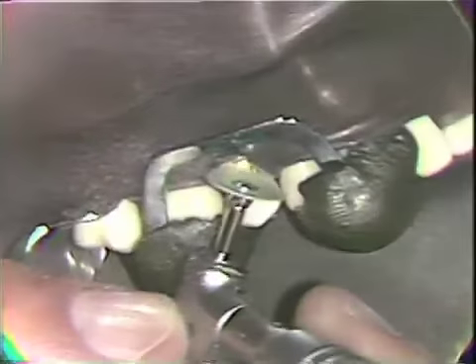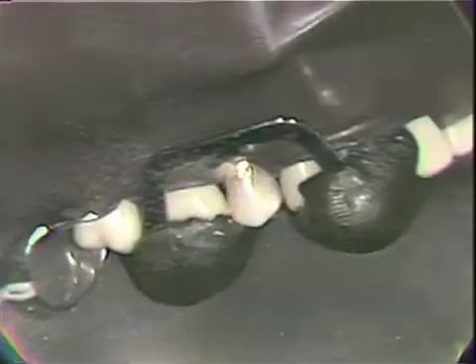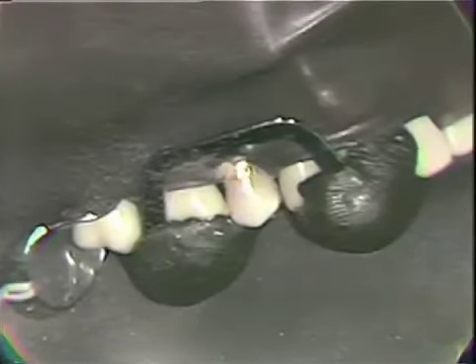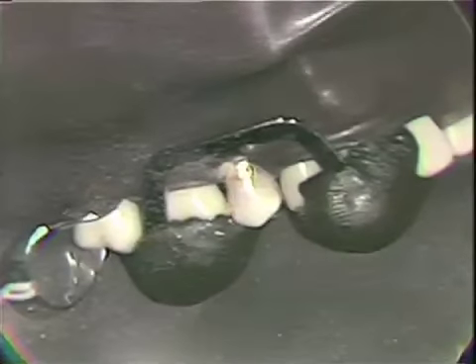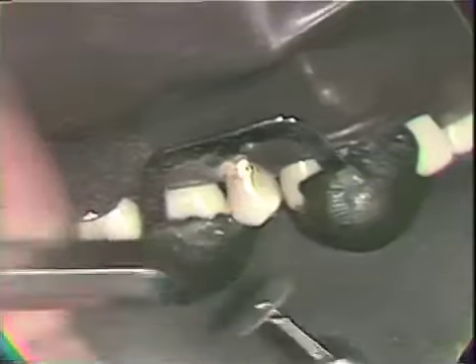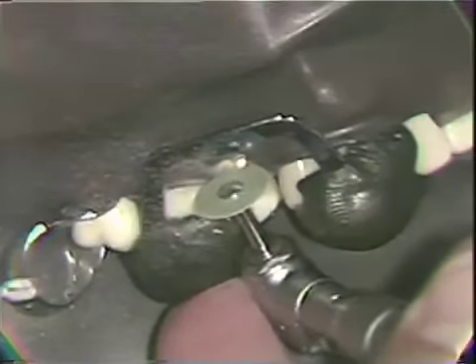Removing material carefully from this area. Let's just change that disc in order that we can establish the contour and develop the kind of surface finish here that's going to be desirable for us. With each of the discs that are used, they should go through the little flexing procedure here to soften that disc so that it does contour on the restoration. Just using the back end of the 5S in order to accomplish that.